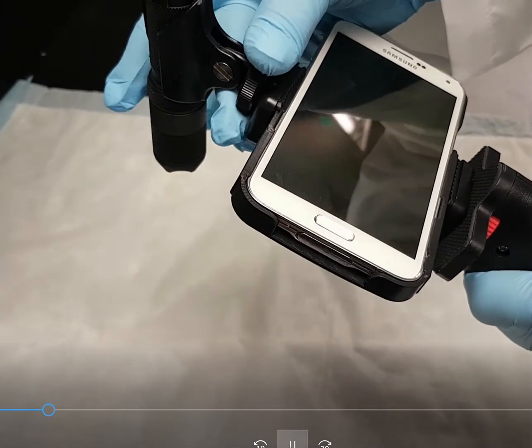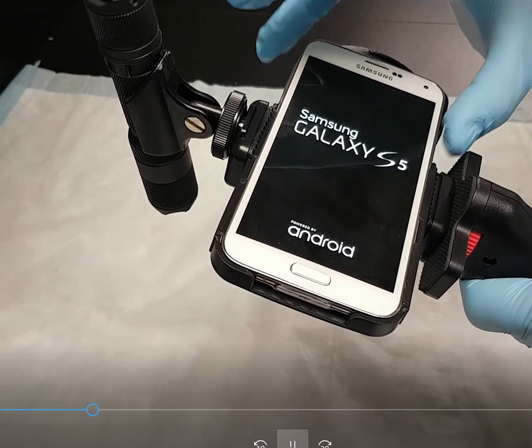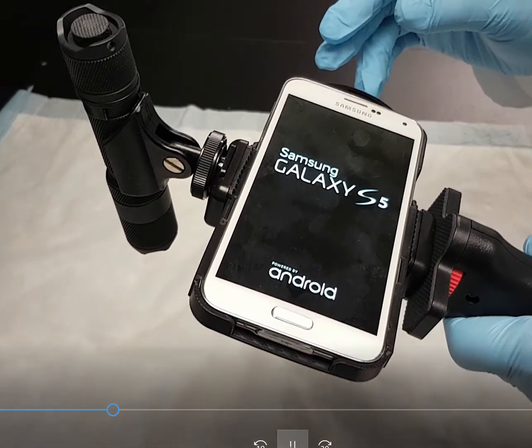The Glowtorch, with its adjustable holder, fits into the hot shoe on the smartphone holder, turning the Forensic Cam into a Forensic Cam Plus.